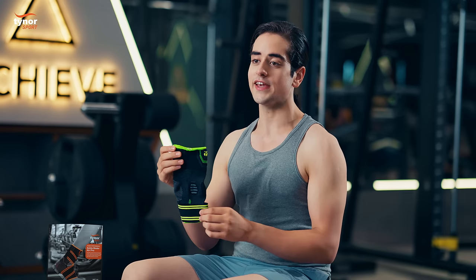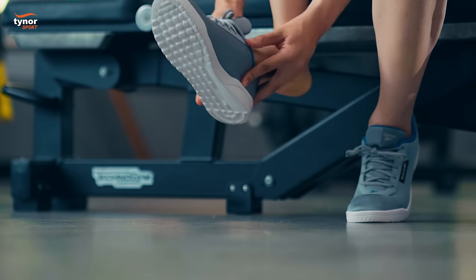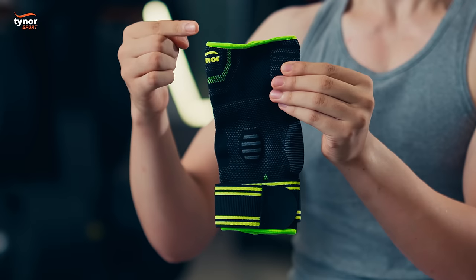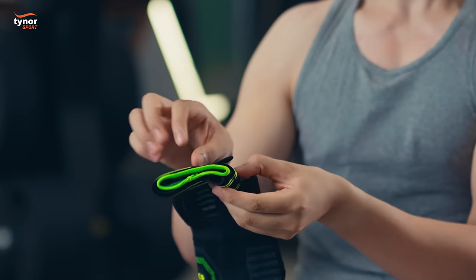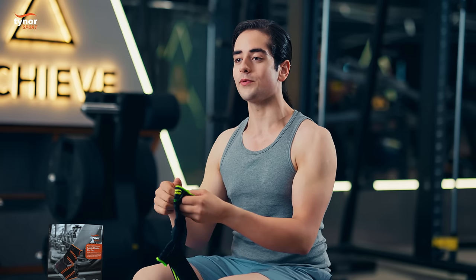Let me show you how to wear the Ankle Binder Air Pro. First, remove your shoe. Ensure that the longer half of the product is facing upwards. Unfasten the hook loop fastener of the product. Put your foot through the product with a simple pull-on action.